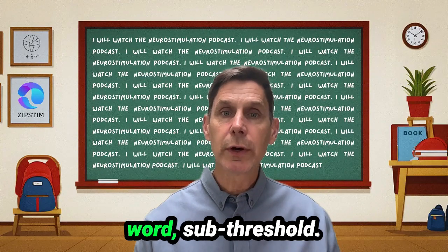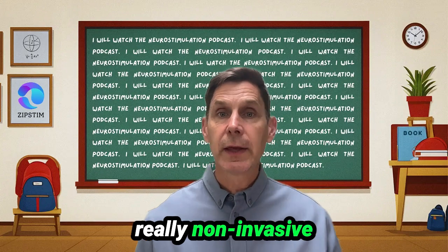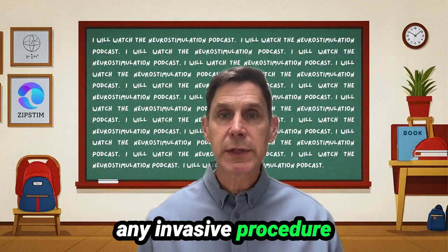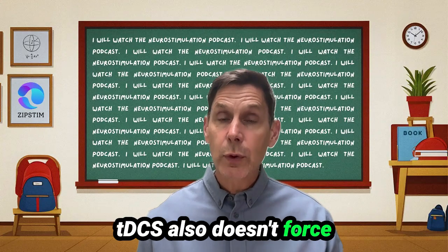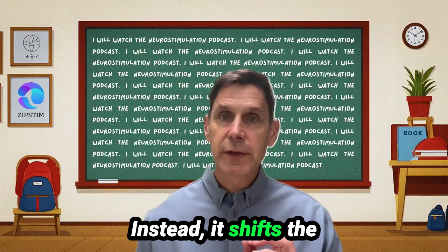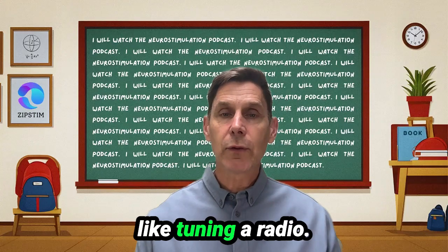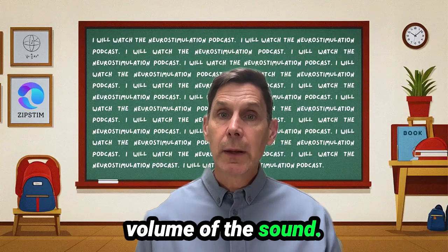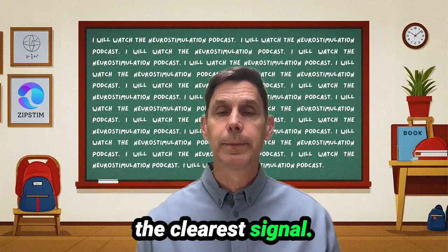And here's the key word, subthreshold. Well, there are two keywords really, non-invasive and subthreshold. tDCS does not involve any invasive procedure into the body or brain. tDCS also doesn't force electrical action potentials. Instead, it shifts the likelihood of neuronal firing. Think of it kind of like tuning a radio. We're not amplifying or increasing the volume of the sound, but we're adjusting the dial until you find the clearest signal.